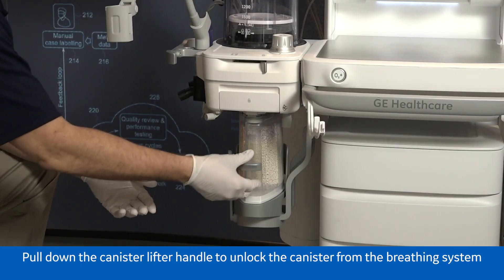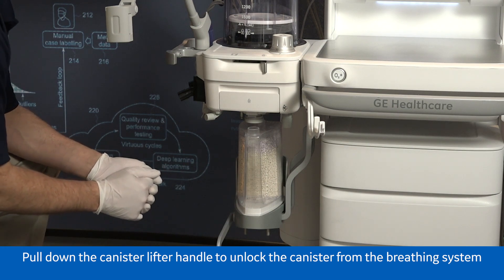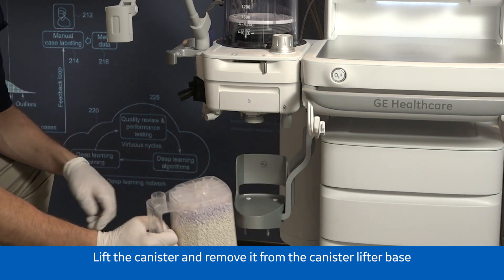Pull down on the canister lifter handle to unlock the canister from the breathing system. Lift the canister and remove it from the canister lifter base.